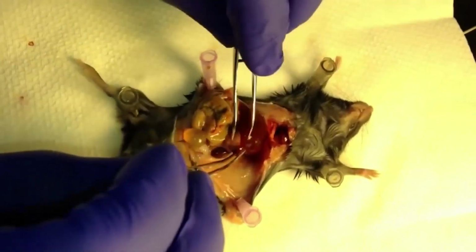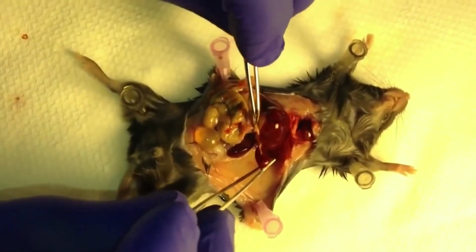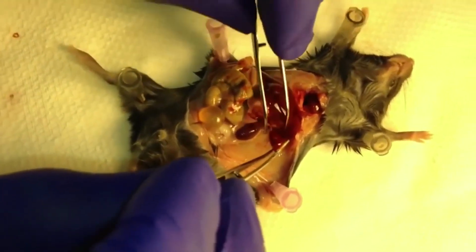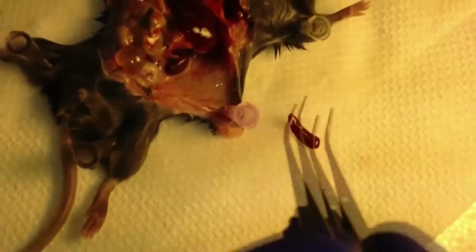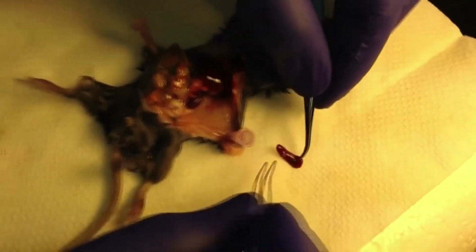Okay, so now you take the spleen out, and you pull the fibers off. You do this slowly so that the spleen doesn't rip, because even though it's pretty firm, it can still rip. Okay, so now I've extracted the spleen, and I'm going to make sure that there's no remaining fat or fiber.